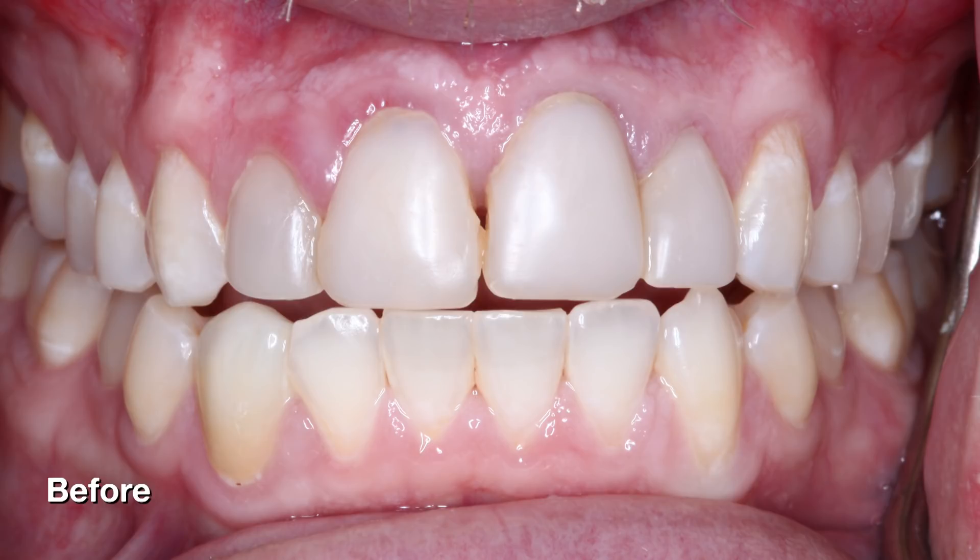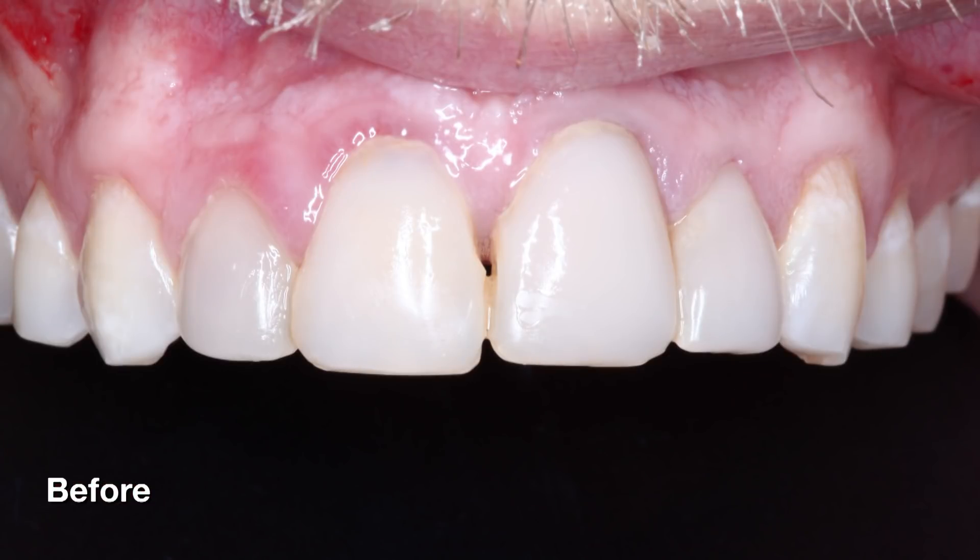We have a 30-year-old male patient that presents with composite bonding on the labial surfaces of his maxillary centrals and laterals. He's unhappy with the aesthetics of the resin placed during his teenage years after he suffered a trauma to this area. Composite bonding was a great option for the situation, but can be very technique sensitive, appearing dull and monochromatic, and extremely challenging for creating natural contours using a direct method. Some of the composite is discoloring and breaking down between the centrals, and overhangs along the margins are causing gingival inflammation, especially around numbers seven and eight.